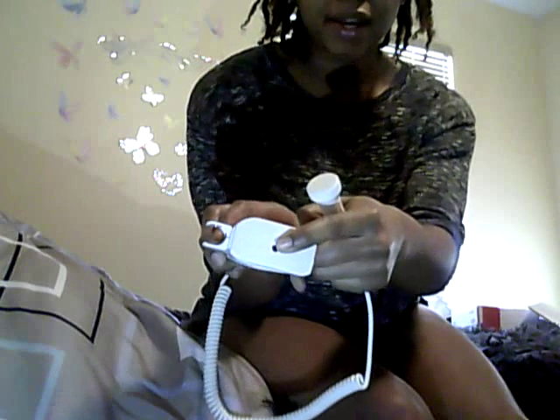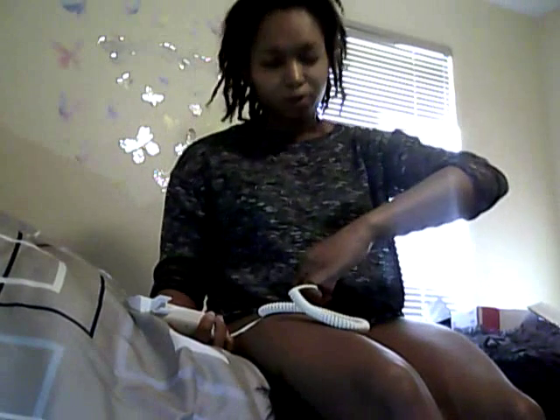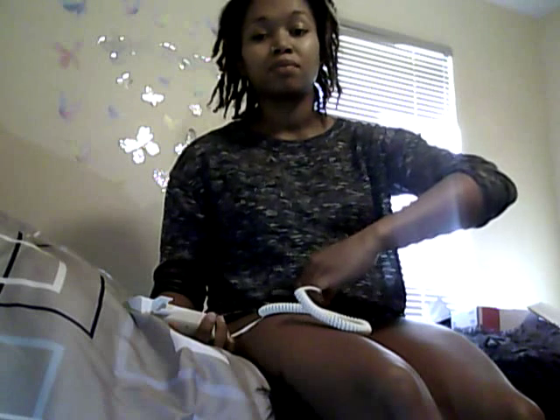It has a light on it. It has a headphone jack so I can put the headphones in my ear and listen to it all night. But I don't listen to it all night because this thing hurts my arm. I have to hold it in the right position for so long, and sometimes it loses signal and then you have to fix it. So, whatever, I'll just get right to it. Oh, so I'm going to turn it on.